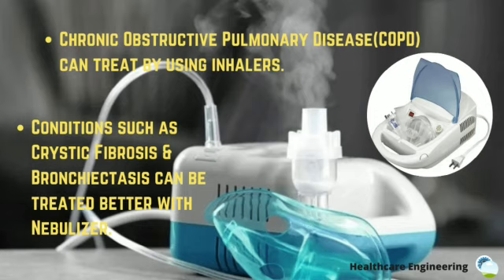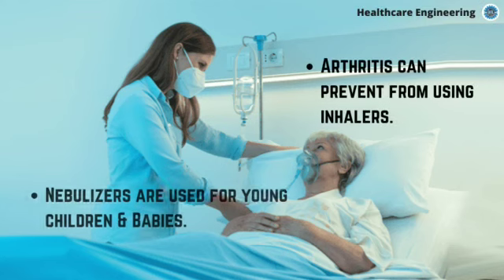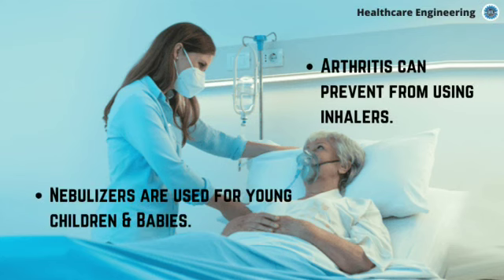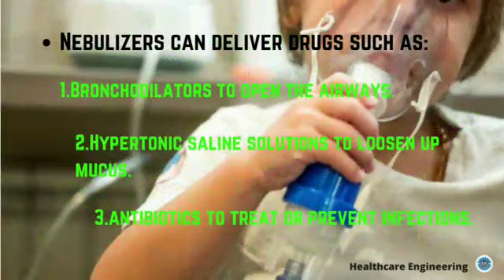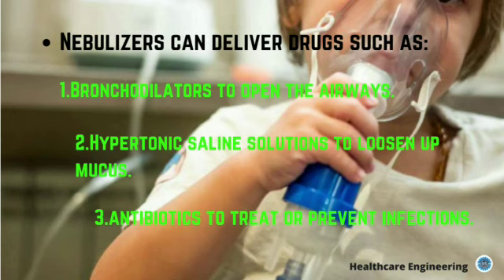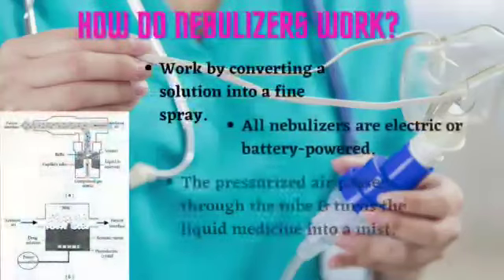Some other health conditions such as arthritis can prevent patients from using inhalers. Furthermore, nebulizers are used for young children and babies. Nebulizers can deliver drugs such as bronchodilators to open the airway, hypertonic saline solutions to loosen up mucus, and antibiotics to treat or prevent infections. Now let's see how nebulizers work.